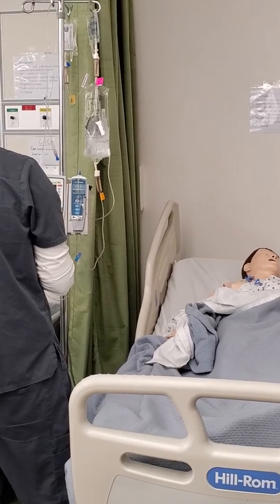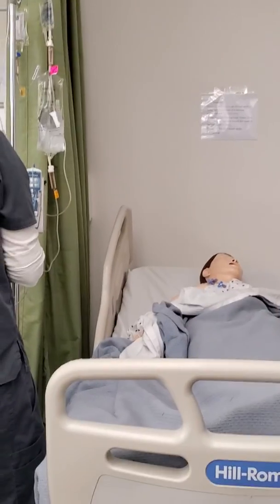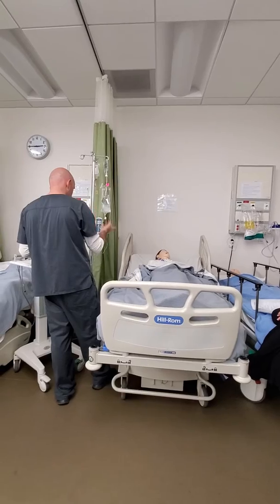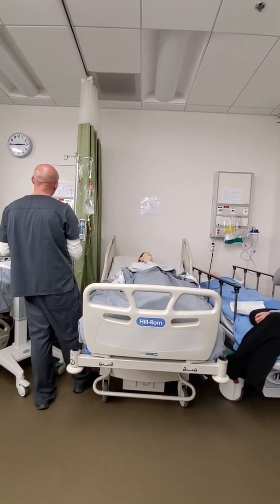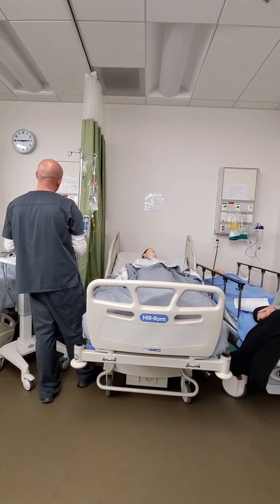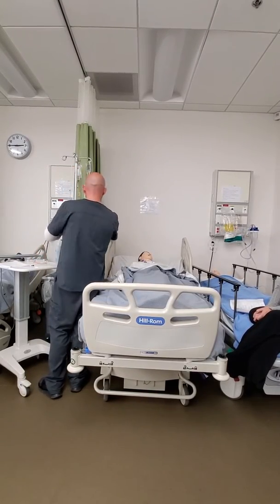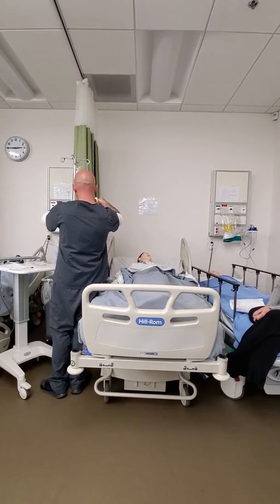It's clear, an unopened bag, and it's for a central line route, and it was due at 2:30. It's 2:45 now, and I want to make sure that this is locked, make sure all my lines are locked.